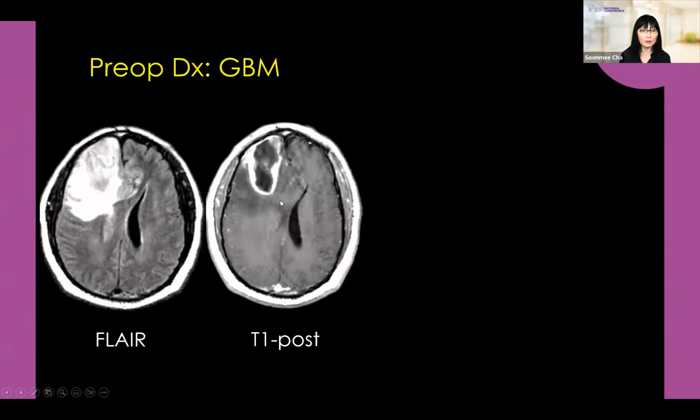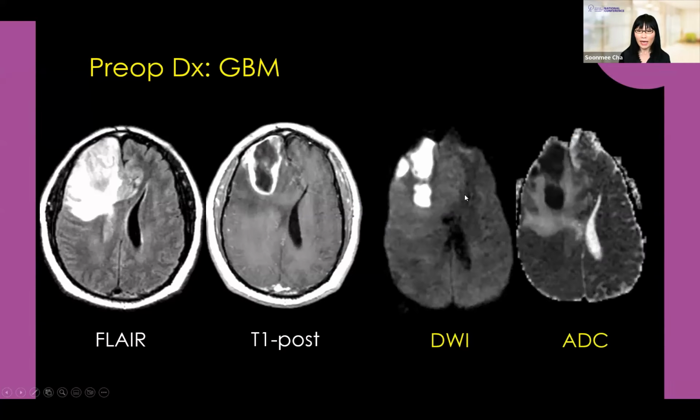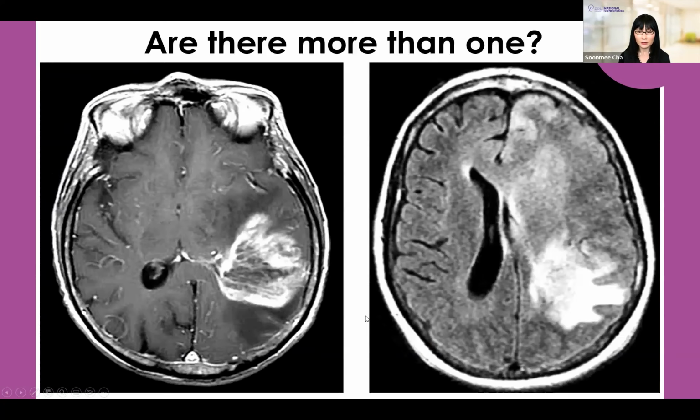Here's a patient who came to us with a presumptive diagnosis of GBM, but once we added DWI and ADC, this does not look like GBM. We told the surgeons, and this is in fact not tumor at all. This is an abscess full of pus.